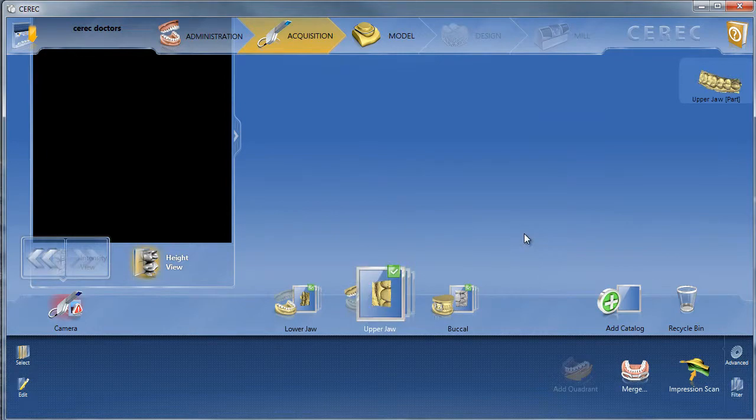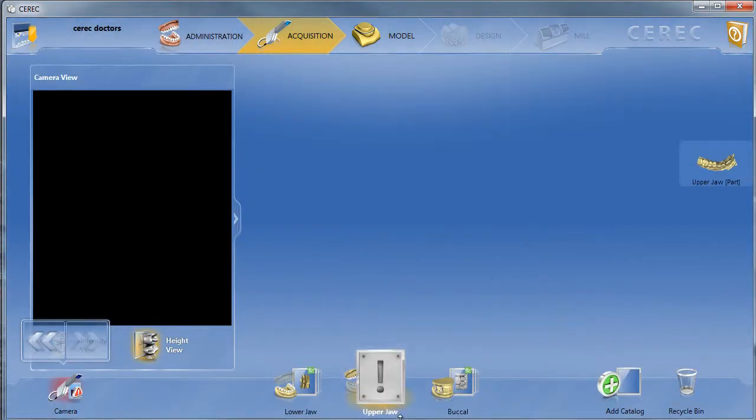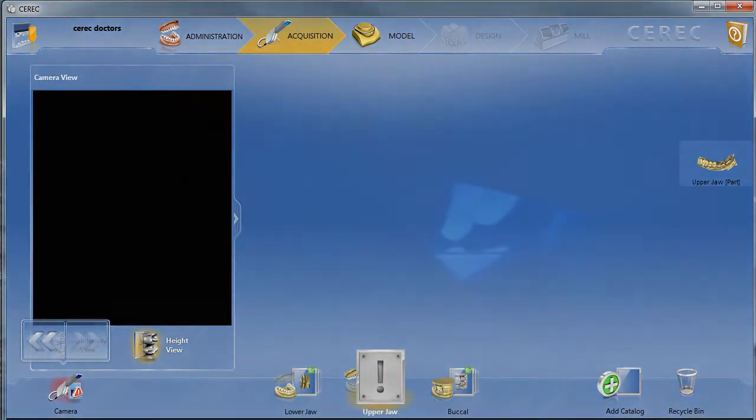These are placed in a save area that you're going to come back to later after you capture the optical impressions. Here's a view of how we capture these optical impressions. Again, you can see how easy the access is — the patient's not moving, the lips are retracted, the tongue's not in the way, the Isolite's keeping the area nice and dry, and we just go around the arch form and capture those optical impressions you saw on the Cirex software.